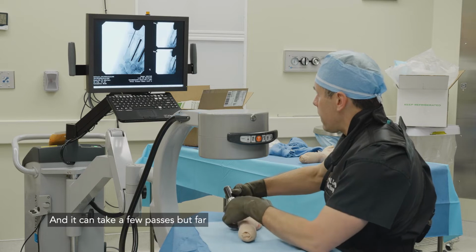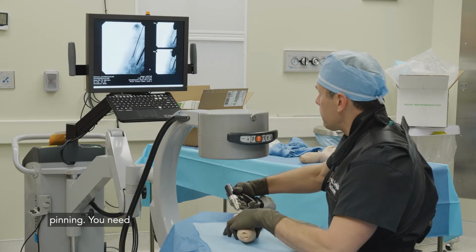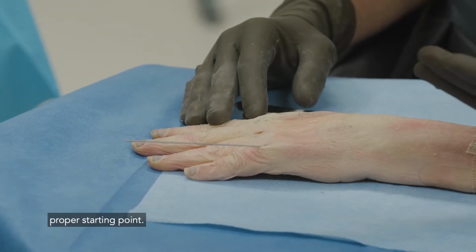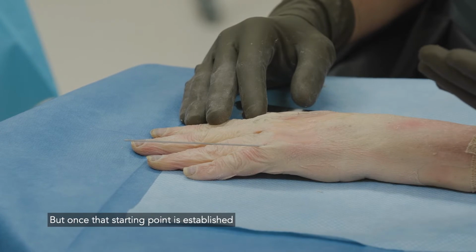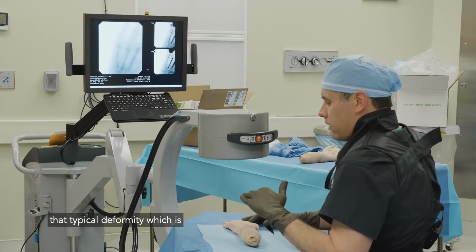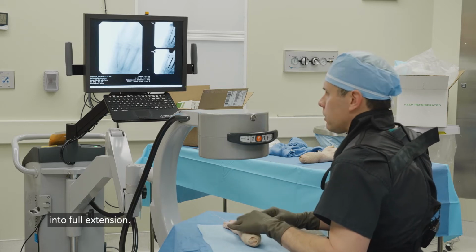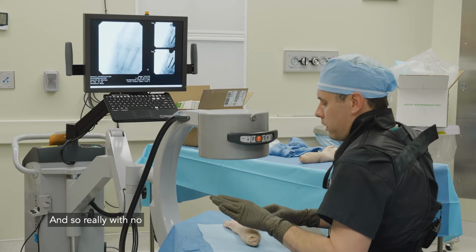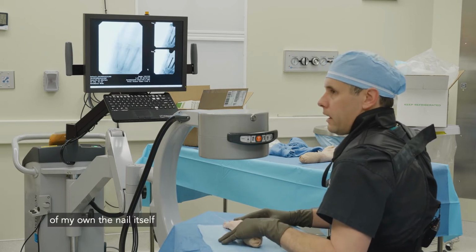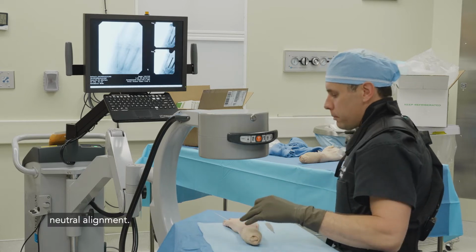It can take a few passes, but far fewer than when you're trying to do cross pinning. You need to spend some time establishing the proper starting point. But once that starting point is established, advancing the nail itself takes that typical deformity, which is a flexion type deformity, and brings it into full extension. And so really with no maneuvering of my own, the nail itself will just force this into a neutral alignment.